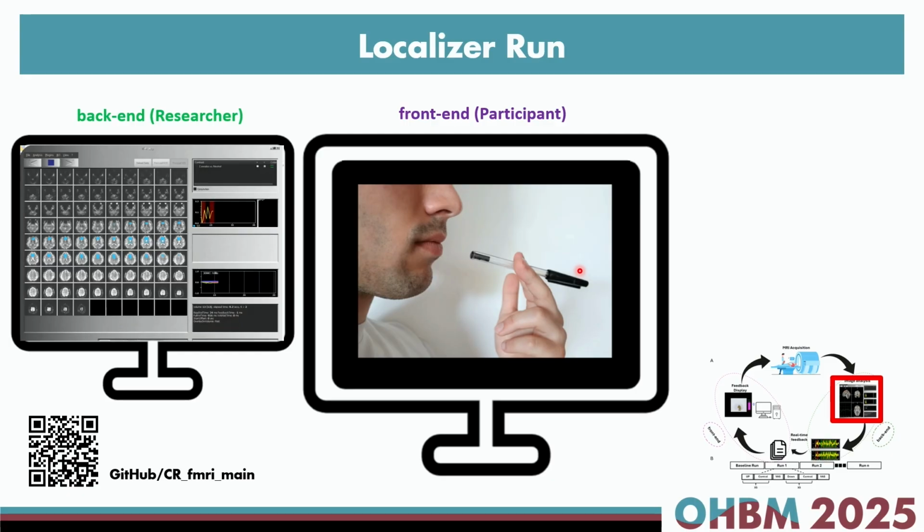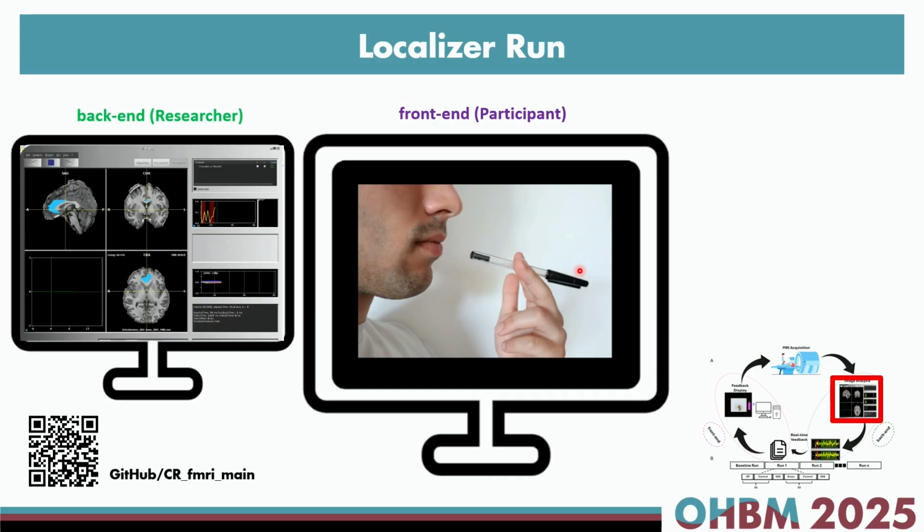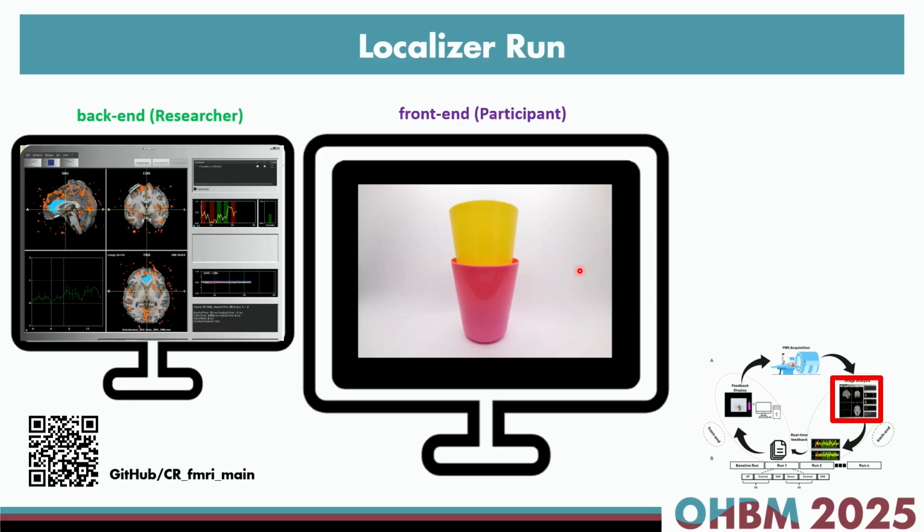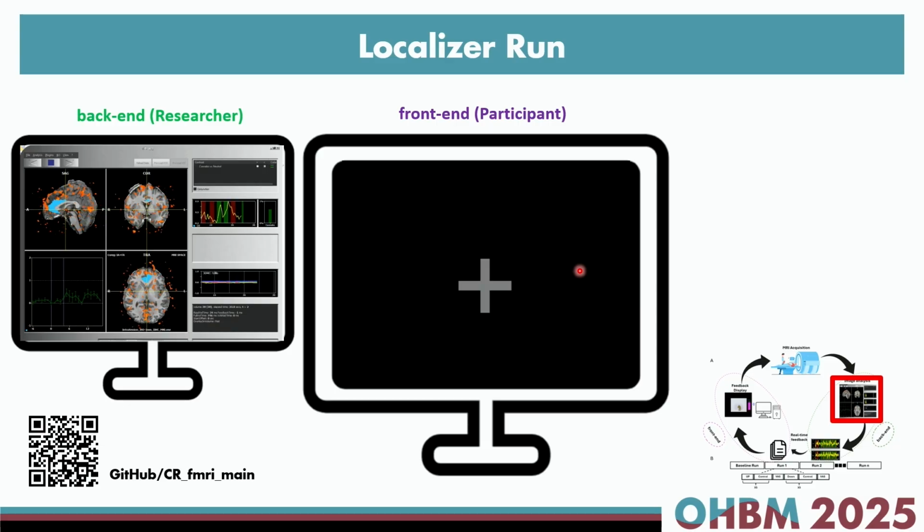So what's happening here, if you look at the left side of the screen, you see that blue part, that's actually our predefined ROI, which was the ACC. At the same time, this is the time that we start scanning, TurboBrain Voyager and the task at the same time. So this is what actually happens.